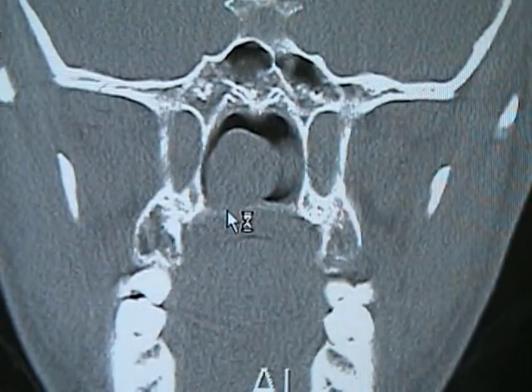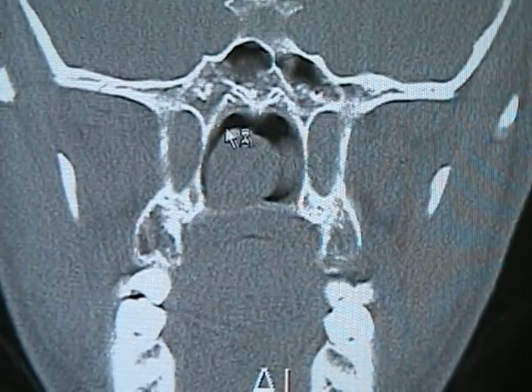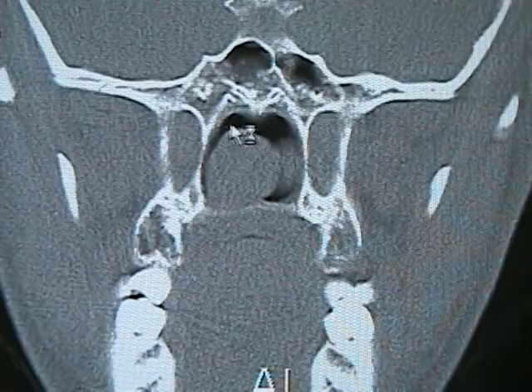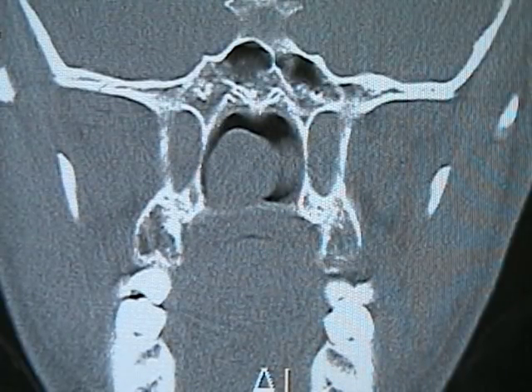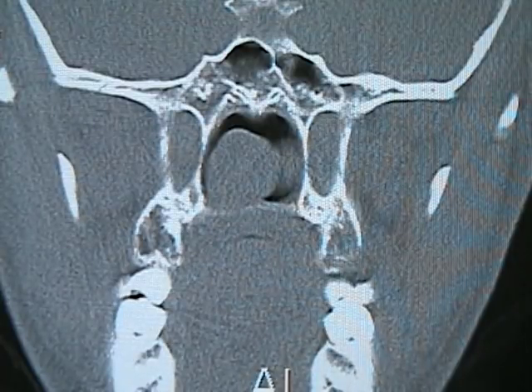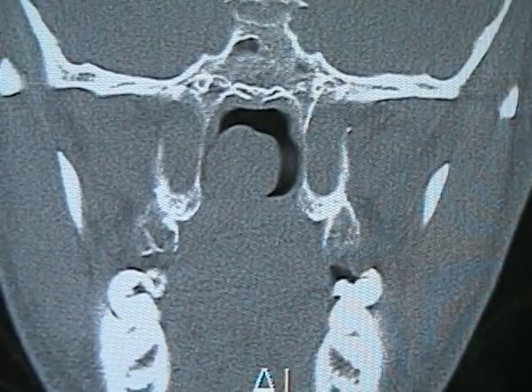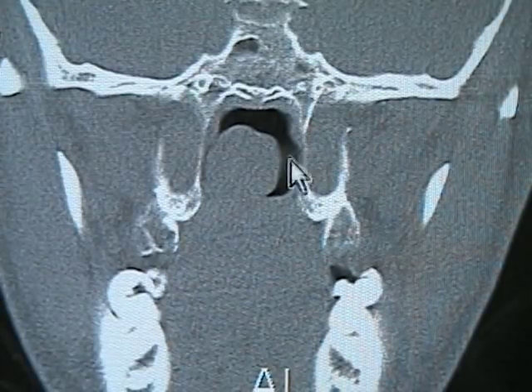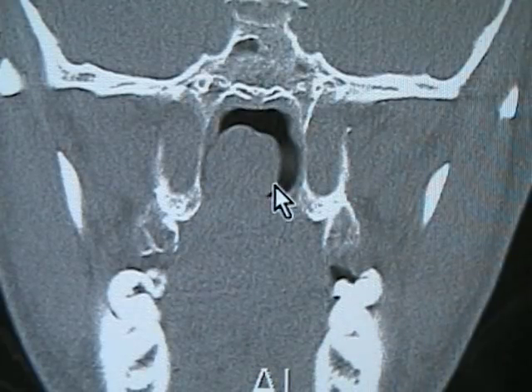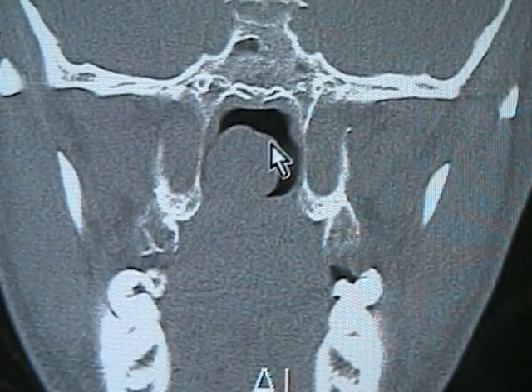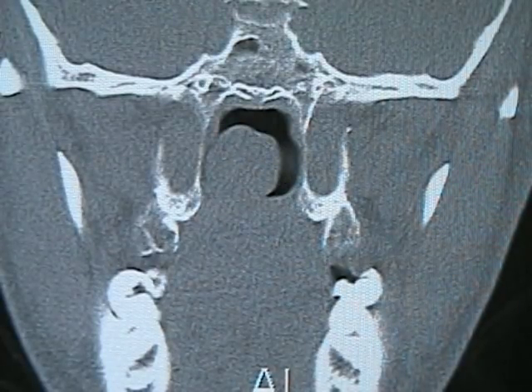The best clue to the fact that this really is a choanal polyp is this round extension which extends beyond the choana into the nasopharynx on the right side — this is the choanal portion of this nasal polyp. Even more posteriorly you can see the size of the choanal polyp and how it is causing significant nasal obstruction in the choana.